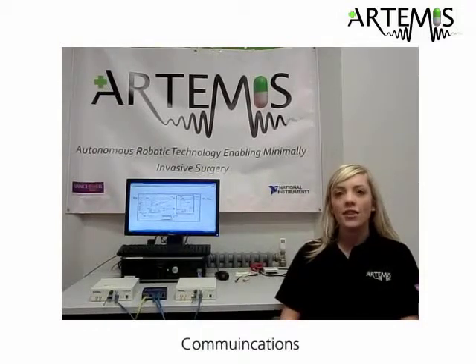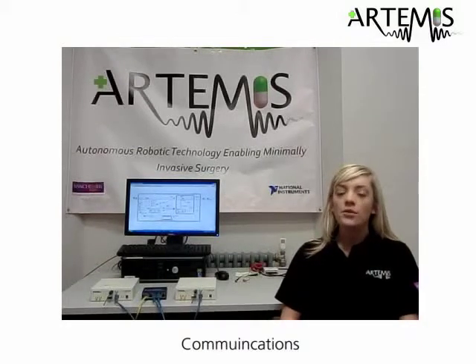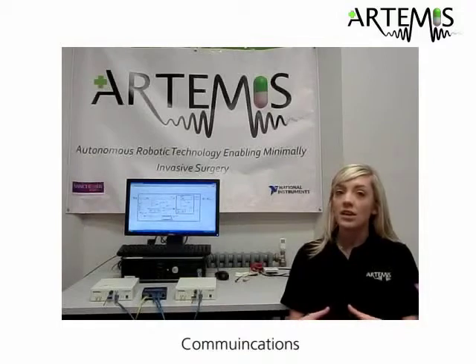The challenge for the communications sub-team was to design a wireless link that could send data through human tissue at a rate of 4,024 bits per second using a minimal amount of power. Research told us that existing wireless technologies such as Bluetooth or Zigbee, although they may have low power consumption in comparison to others, still provide higher data rates over a larger distance than we required for this project.